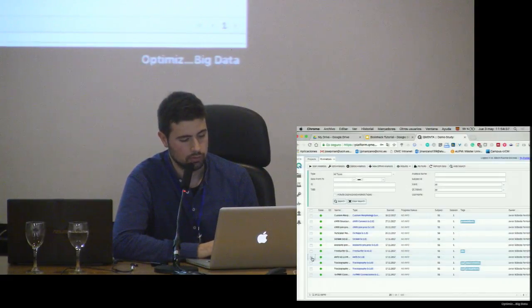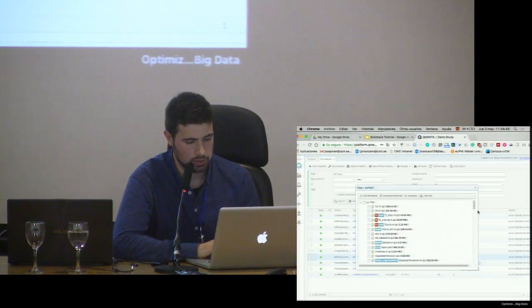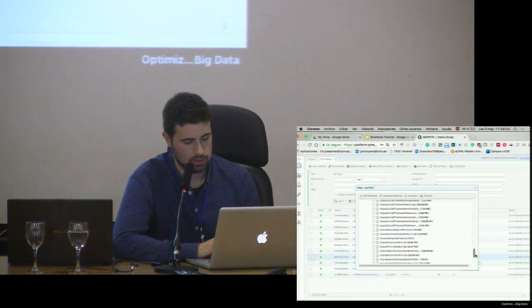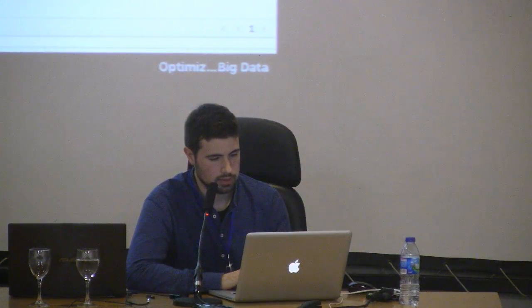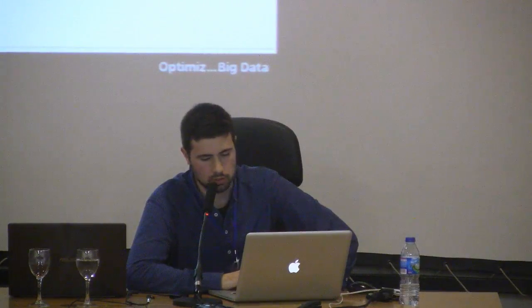For instance, if we run ANTs, which is an open source normalization tool for structural MRI images, you can see here that this analysis has produced all these results, which are segmentations of the brain, and CSVs with the cortical thickness of all these regions in the brain. And then you can see that it also produces a PDF report with all the results. You can also see directly the important results by clicking inside. And this will eventually load the segmentation and the cortical thickness for this patient.